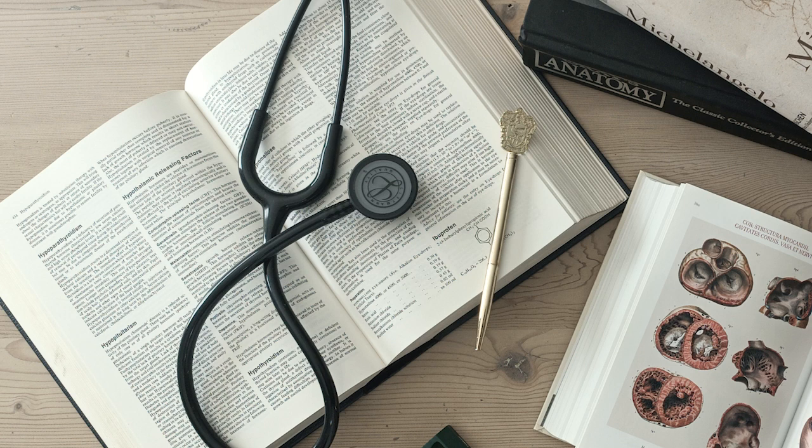Got it. We generally see two main types of VPCs based on their ECG morphology, which can sometimes give clues about their origin within the ventricle. What's the first type of VPC? The first type is an early but relatively normal-looking QRS. Well, maybe not normal, but narrower than the classic VPC.